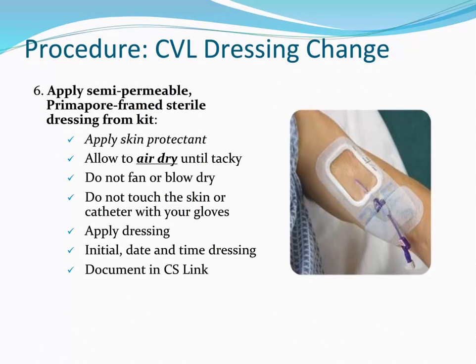Apply skin protectant and let this air dry until tacky. Once again, do not fan or blow dry, or touch the skin or the catheter with your gloves. Just give it 20 to 30 seconds and you're good. Apply dressing. Initial, date and time the dressing. Document this activity in CS Link.